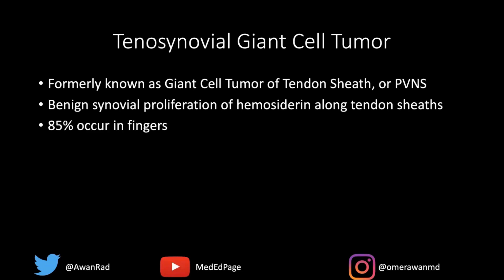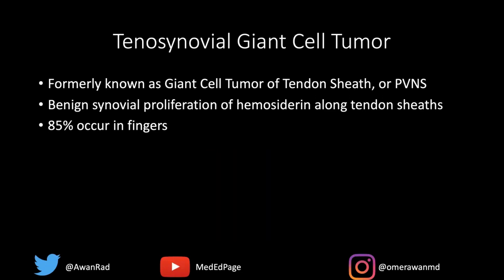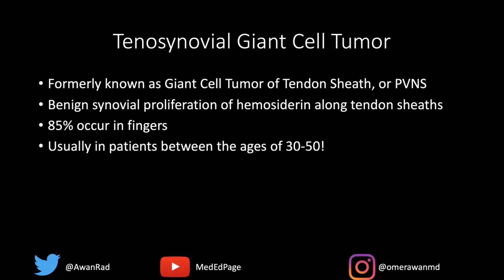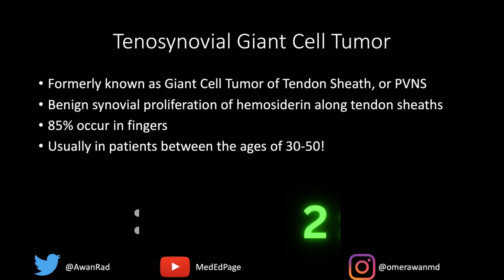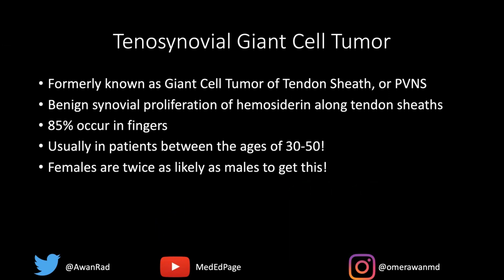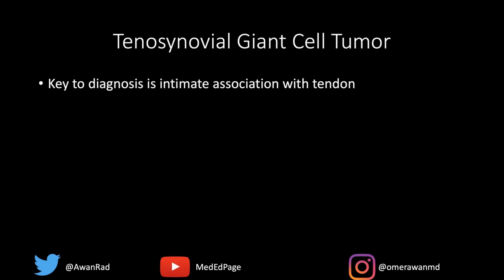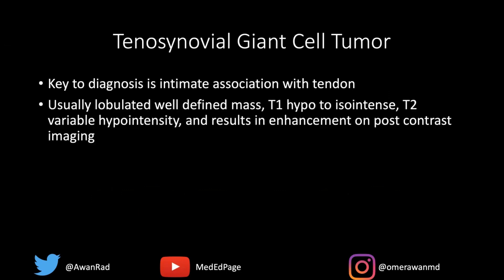This most commonly occurs in the fingers — 85% of cases — but as in this index case, it occurred in the toe. It is usually seen in middle-aged individuals between 30 and 50 years old, and females are two times as likely to get tenosynovial giant cell tumor than males. The key is identifying the intimate association between the lesion and the tendon or tendon sheath.